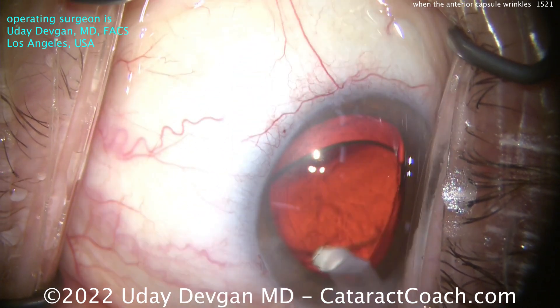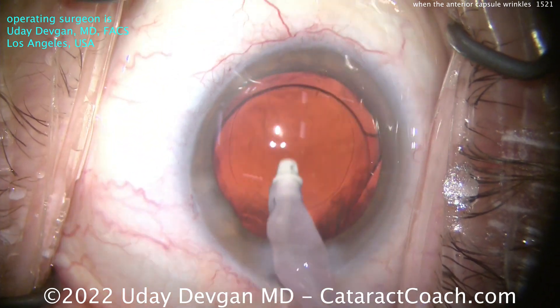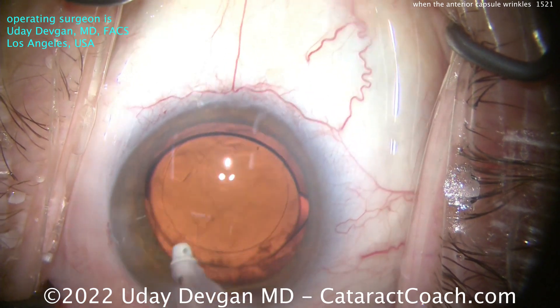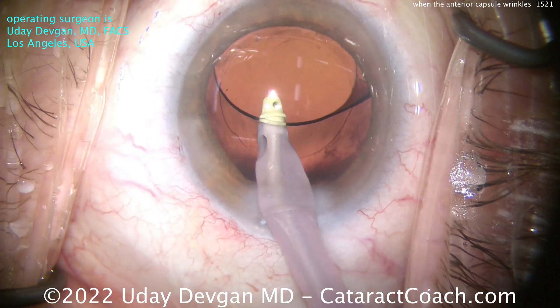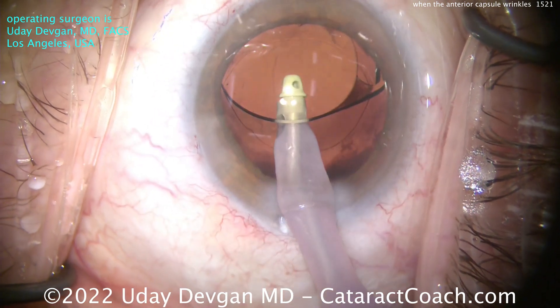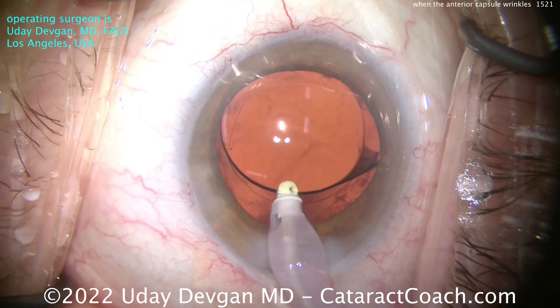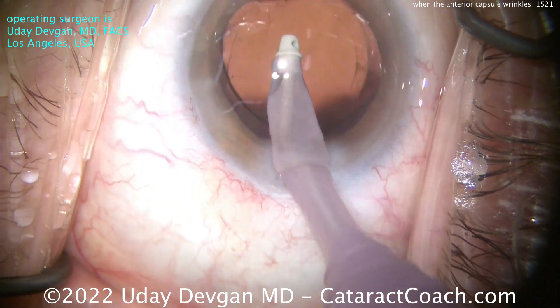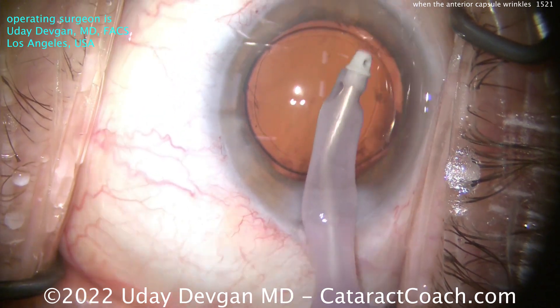Let's go gently behind the optic and remove our viscoelastic. Going a little bit slow motion here to see what's going on. Now we're lifting up the optic, getting the tip of the IA probe behind the optic, getting all that viscoelastic out. This is the cohesive viscoelastic — it's a lot easier to remove. Remove that viscoelastic, get the lens set up, and clear out the anterior chamber, making sure there's no viscoelastic left.